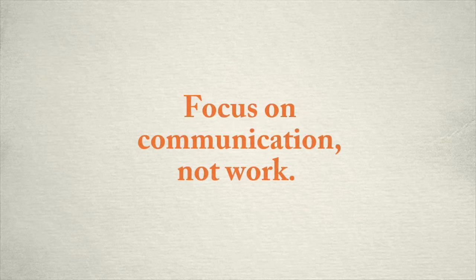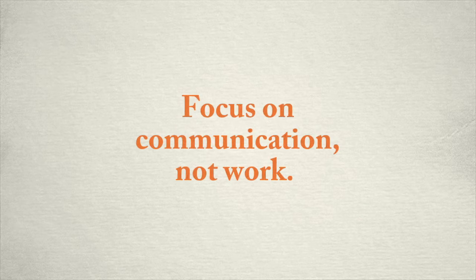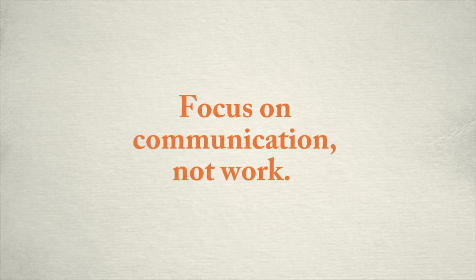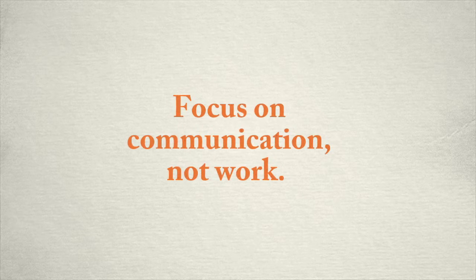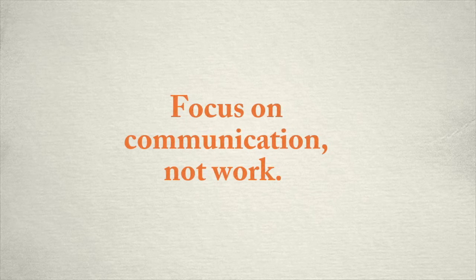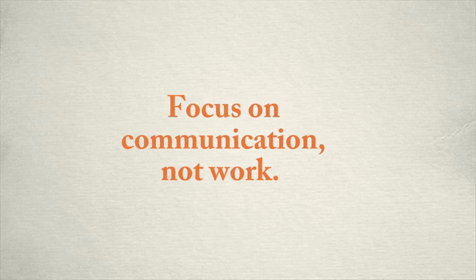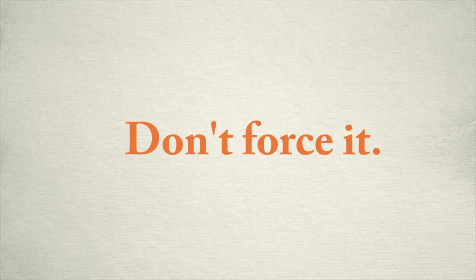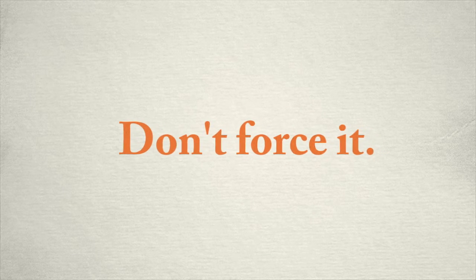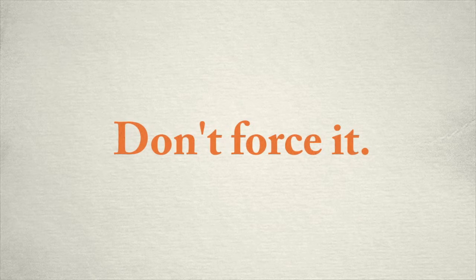When you do this, the PODD turns into work, and that individual will not take the PODD to social gatherings such as a birthday party because they have learned the wrong purpose for the PODD. They don't want to work at a birthday party, they want to communicate. Don't try to force using the PODD. Just continue modeling it yourself, and eventually you'll see an outcome from the individual you're working with.